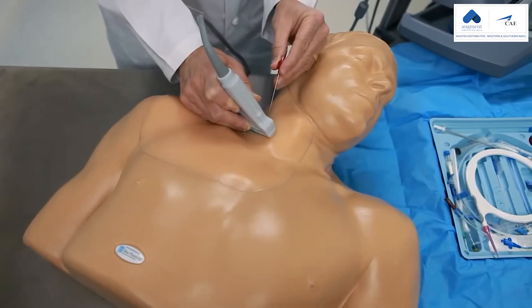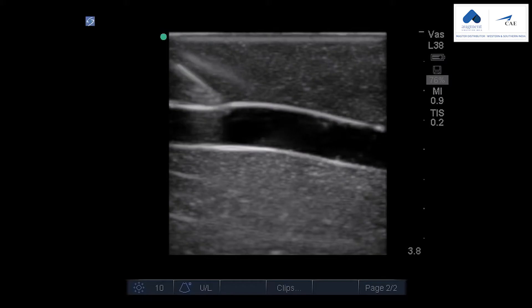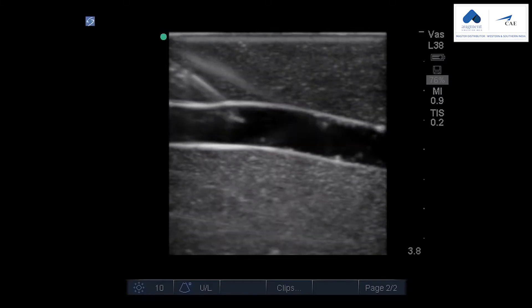This model has all the vessels you need to teach, learn, and practice central venous access procedures. Or as an option, you can add nerves so you can practice regional anesthesia procedures.